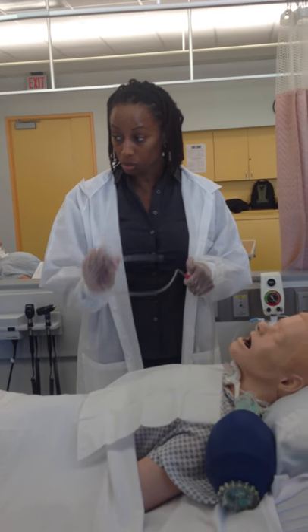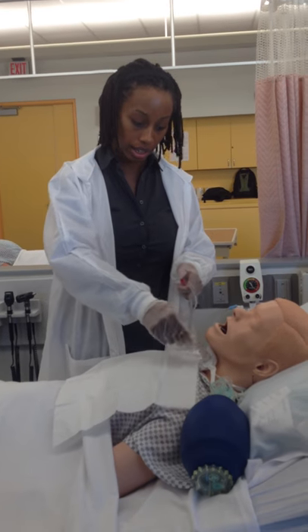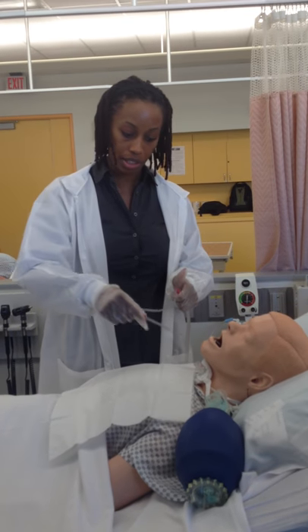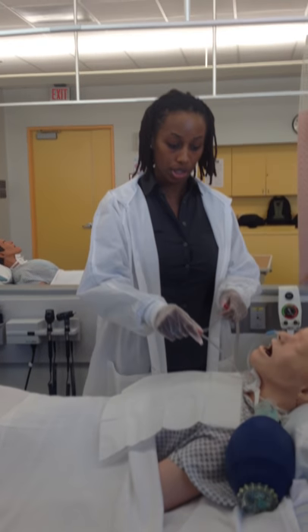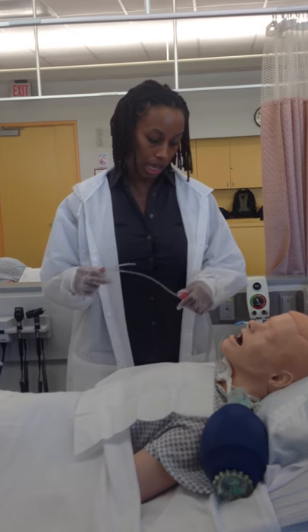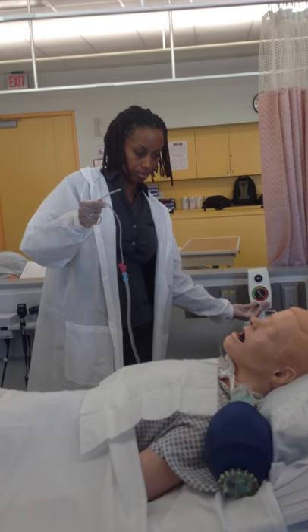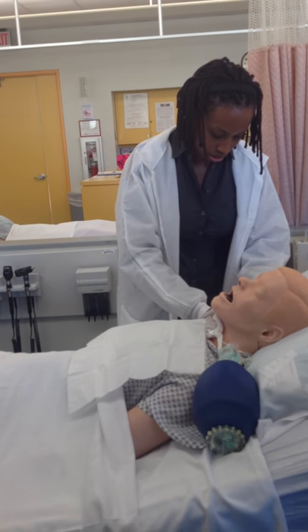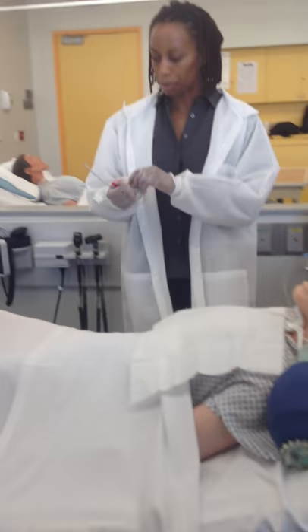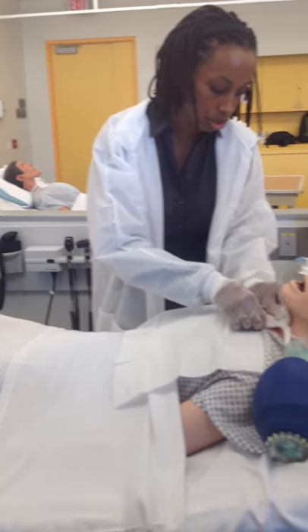This is really the sterile part: the suction catheter, this hand, and going in and out. The last thing you want is for this to touch everything and then push that down into their lungs. Once you're done with that, now I'm going to change the suction dressing and the tie. You can separate all this — you're done with this. If you want, you can blow this up into your glove and toss it. Before I put on my second pair of gloves, go ahead and remove this dressing.